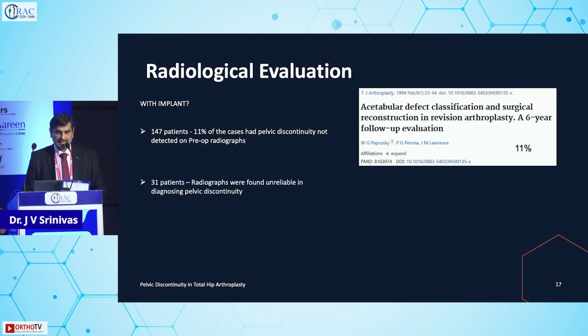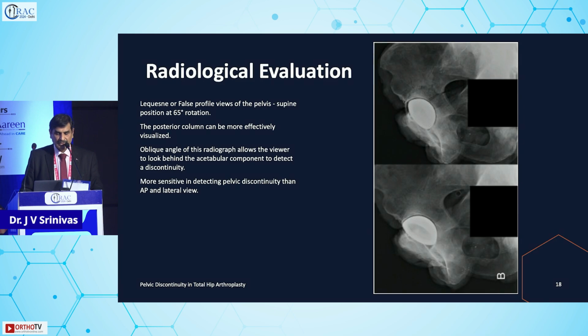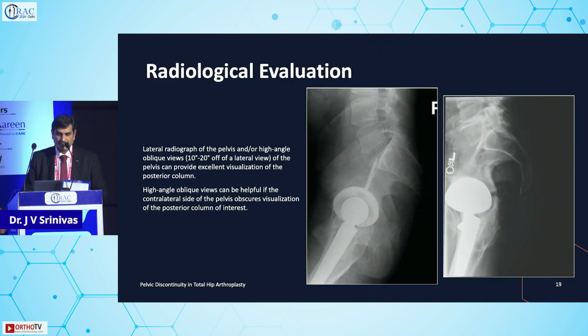In one of the studies, 11% of cases of pelvic discontinuity were not detected on preoperative radiographs when they went for revisions. And 31 patients' radiographs were found unreliable; only plain X-rays were unreliable. So this is a special view, where you have to do a 65 degree rotation to see the medial side of the acetabular component to diagnose your pelvic discontinuity. Sometimes a lateral view also helps to diagnose a pelvic discontinuity.